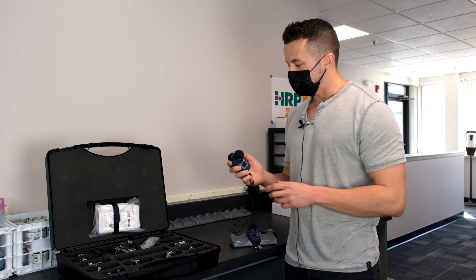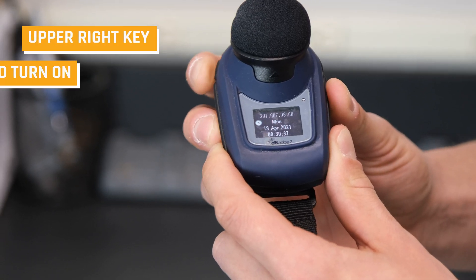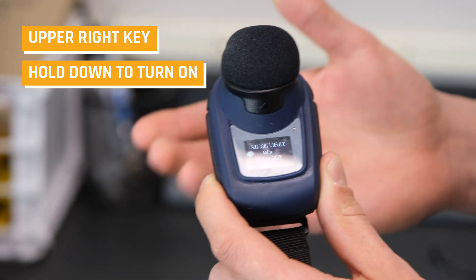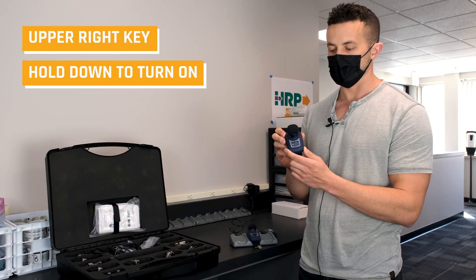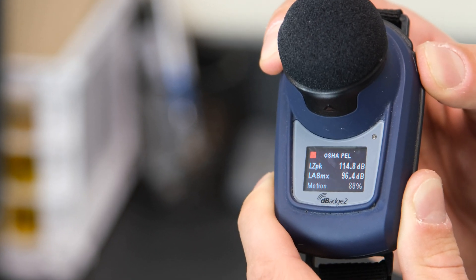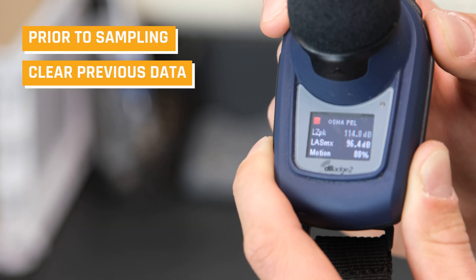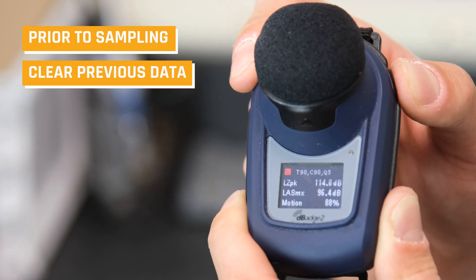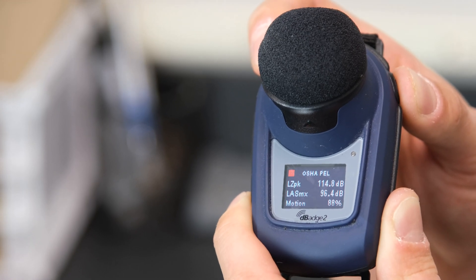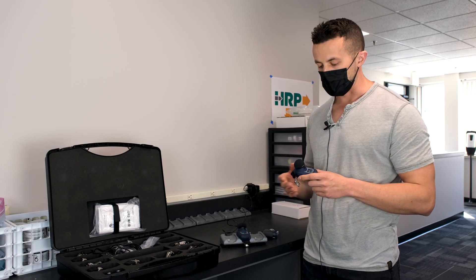First thing you're going to do is turn on the sample by holding down the upper right key. The sample is going to power on and then we have our interface. You can scroll through it to see the data prior to sampling, make sure it's fully charged, and then we like to clear the data. That can all be done via the computer interface through the Casella program for these D-Badge 2s — plug it in prior to sampling and clear the data out.